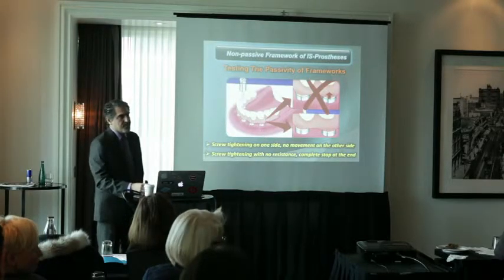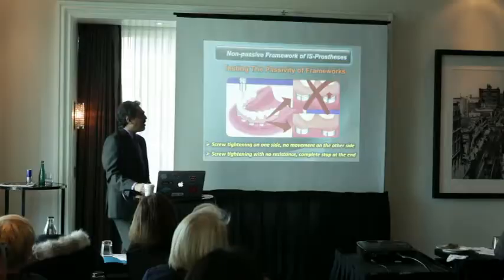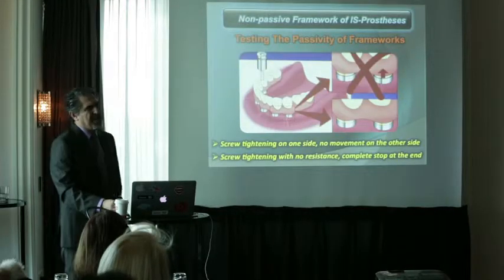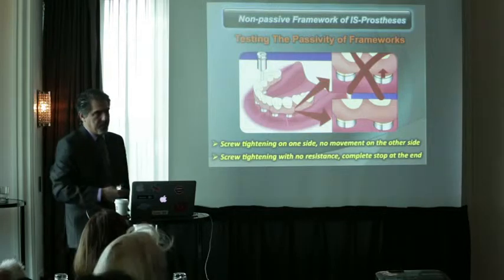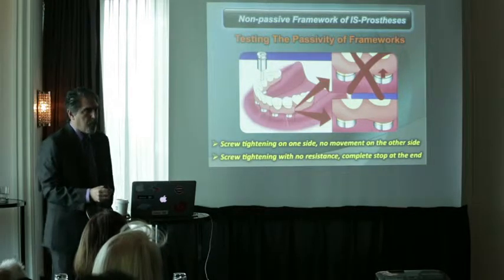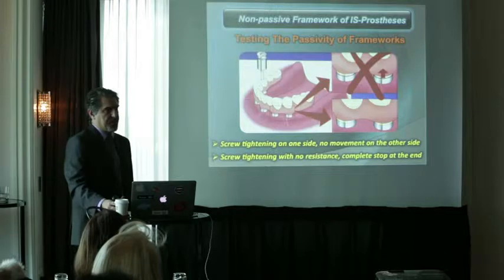These screws, you don't torque them, right? You just hand tighten? No, torque them to 15. Usually hand tightening is less than 15, so it's better to go for 15. Yes, these are prosthetic screws.